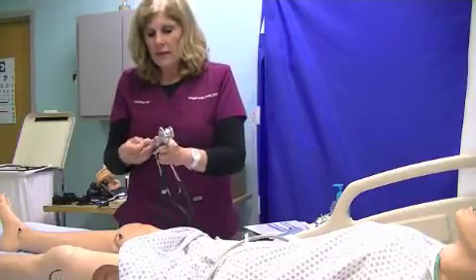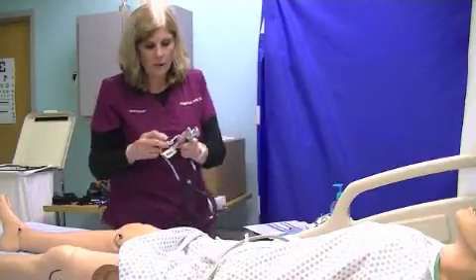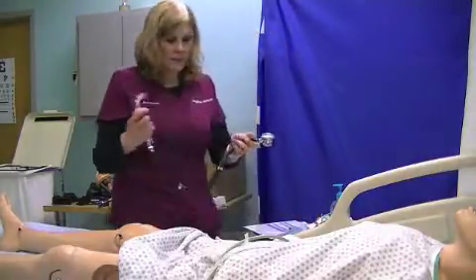Make sure you clean the earpieces too, because you don't want the earpieces in your ear, especially if somebody had some kind of ear infection or something. You don't want to transmit it. So you want to make sure you clean that.